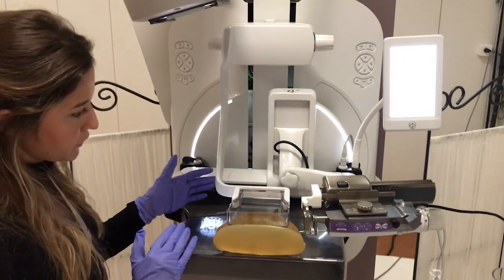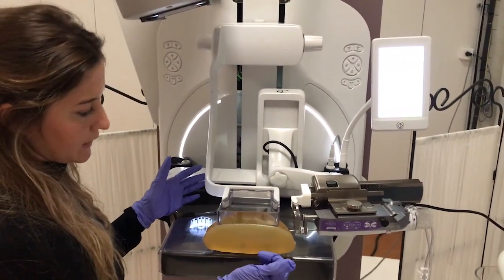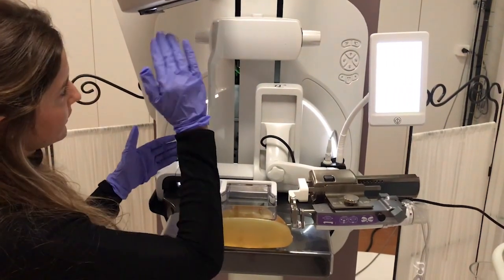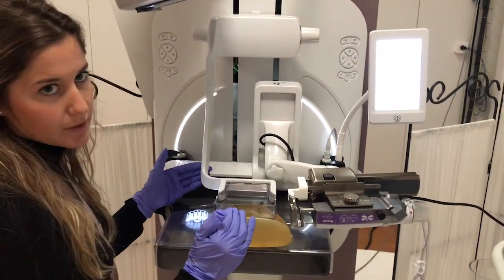During the sample exposure, the breast is still compressed with the needle inserted inside, so that if it's not conclusive you can easily proceed to sample again. Also, because of this little blade, the breast is actually not re-exposed.